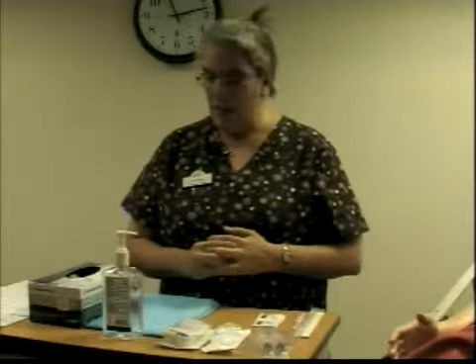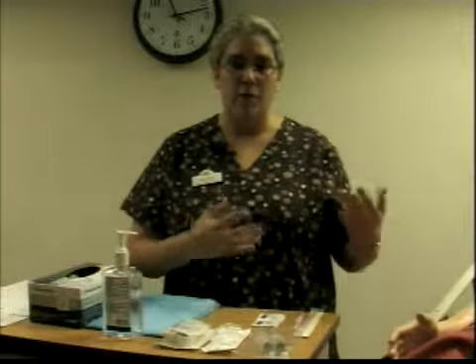One of the big things that you want to know, as I mentioned before, is to know your patient's history. This is the part of the nursing process that you want to have before you come into the patient's room. You want to do your assessment, and what kind of assessment do you want to have before you do this? First, you want to know the patient's medical history.